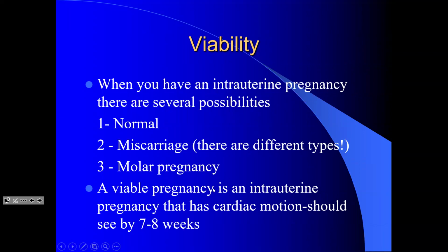Yeah, abnormal fertilization between sperm and egg results in an abnormal sort of pregnancy where it can be partial or it can be a complete molar pregnancy. So we saw this. I showed you a few examples of this. So we'll go through that again. Okay. So we'll talk of all 3 of them again, so that we know what exactly we're looking for.